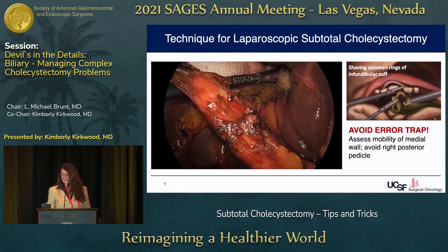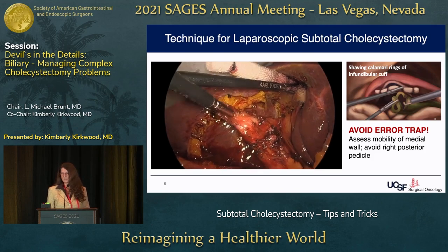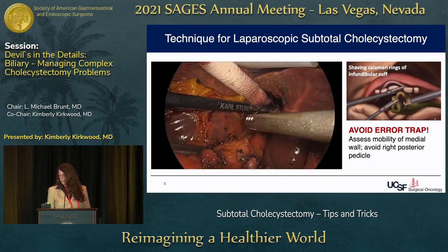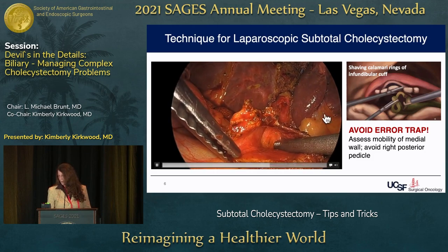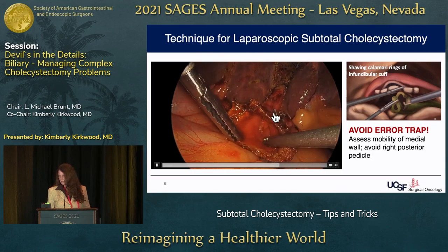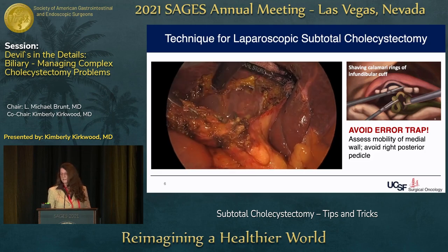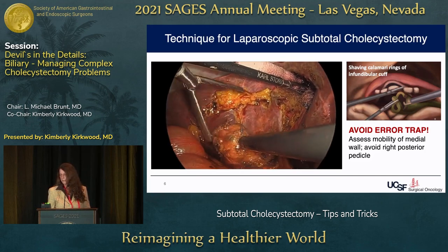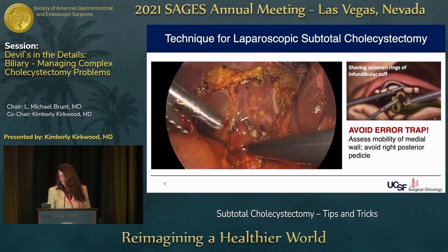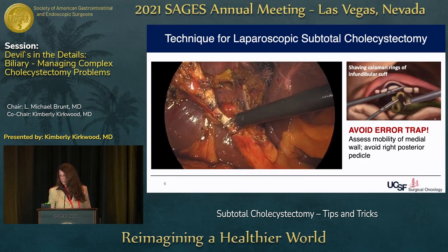For this older patient, I'd prefer not to commit him to a biliary fistula. I've already discerned bile coming through the cystic duct — sometimes a severely inflamed and occluded cystic duct means you don't have that risk. I can look inside the infundibulum, get remaining stones, assess wall thickness from multiple vantage points, and stay right submucosal. I pull on it to see if it comes away from the liver — if it doesn't, we're done. I knew I needed a cholangiogram due to elevated LFTs, so I took additional calamari rings off circumferentially to safely reach the cholangiogram site.